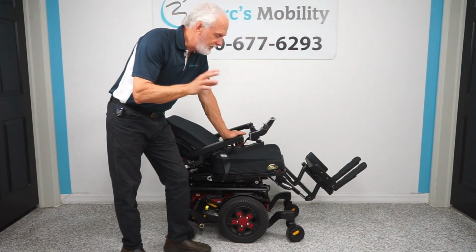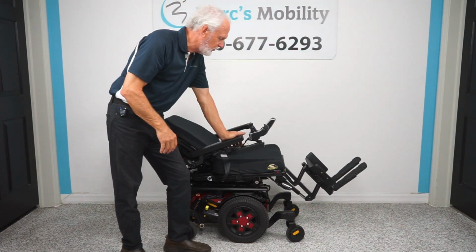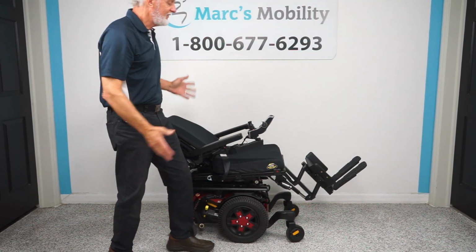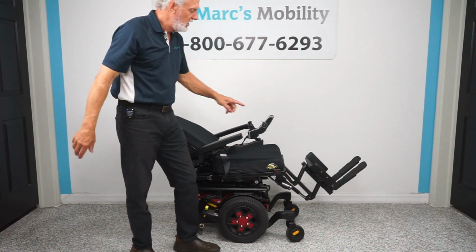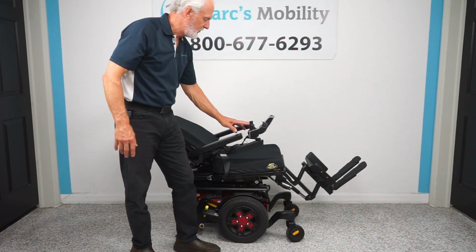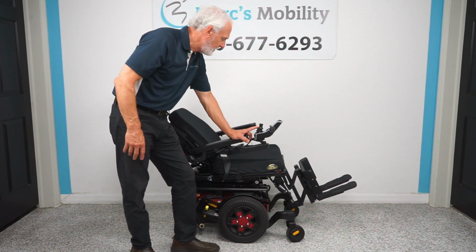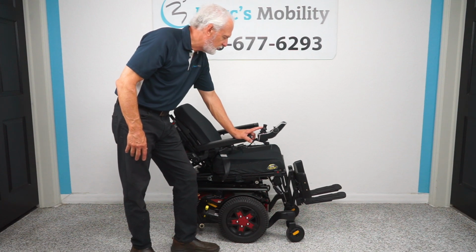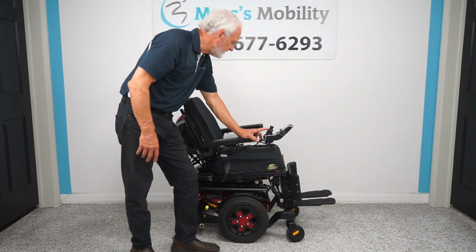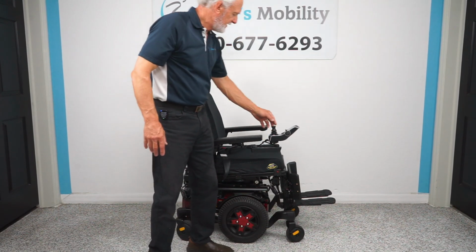One more thing. If you ever have a red X in your screen, a little circle with a red X, that means you can't drive because you're too tilted, too reclined. You have to bring those positions to a certain level and the red X will go away, it'll turn green and your chair will drive again. So just to let you know, because I get this call a lot, it's a red X, I can't move my chair. And I have to tell people, bring your tilt, bring your recline back up. Let's bring the legs all the way in. There we go. Let's put it back in drive.